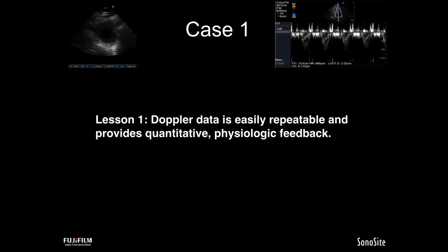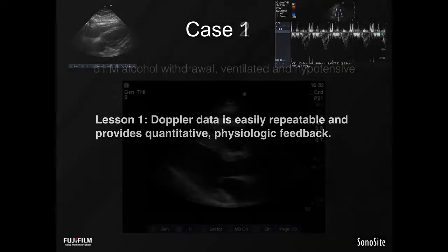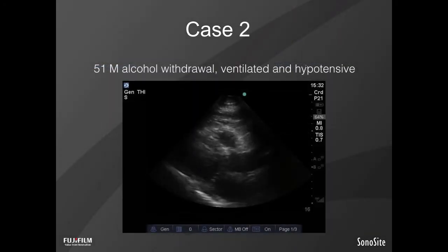Nothing too fancy here. We have a depressed ventricle, we start some inotropes, but we see right away it's working, and we can move on to other aspects of the patient's multi-organ failure.